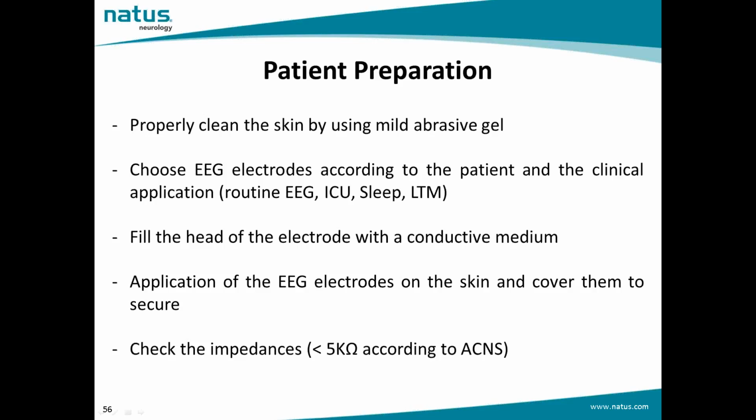The patient preparation is a very important part of the EEG methodology, and it should be properly performed before starting a new EEG recording. Here we have all the steps for your review and reference.